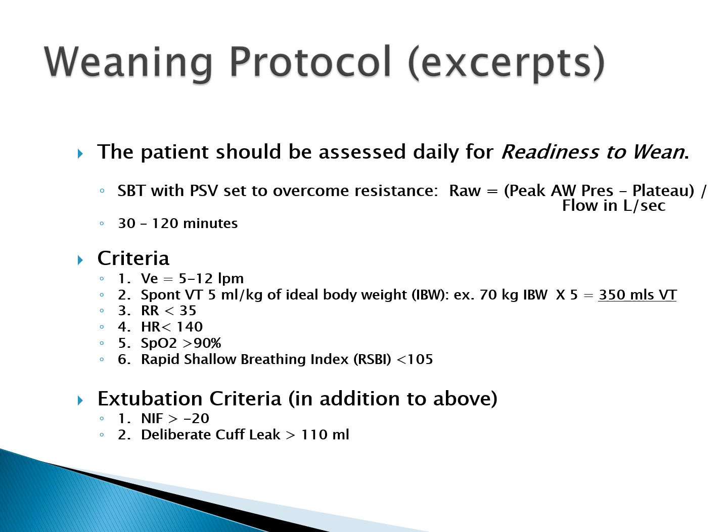Extubation criteria: a NIF of at least -20, and a deliberate cuff leak of, depending upon the tidal volume, at least the low 100s, but some of them say 150 to 200. It depends on the actual tidal volume that the patient's getting.